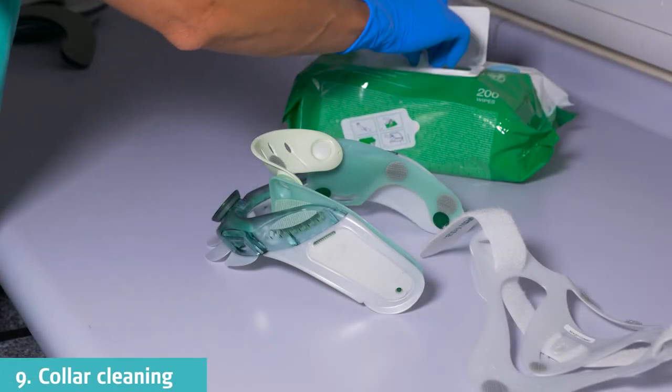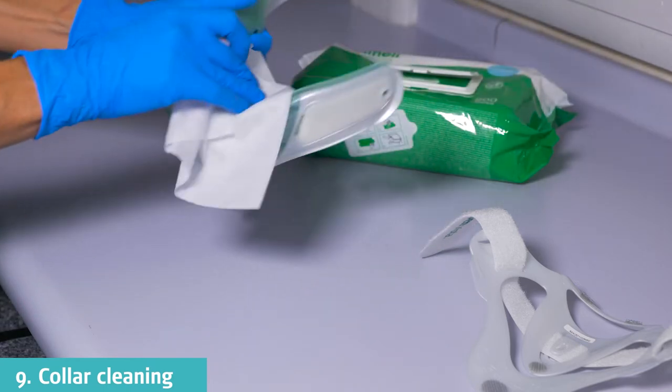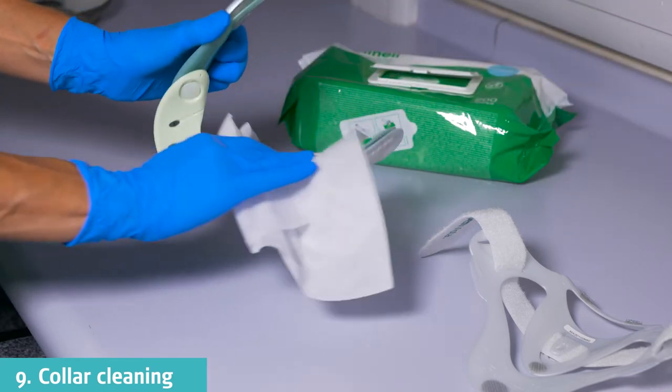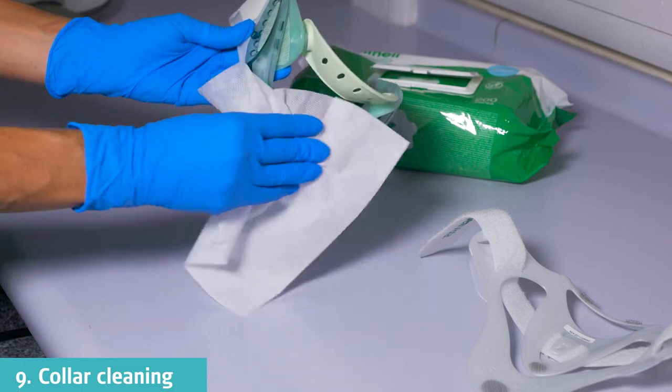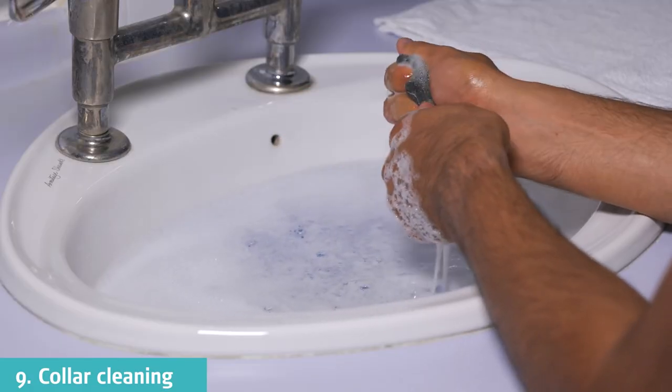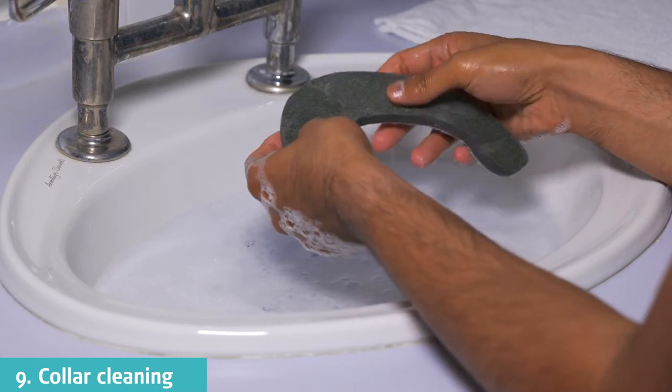The plastic components can be cleaned with either mild soap and water or a disinfectant wipe. Ensure it is dry before the pads are reattached. The pads can be hand washed with mild soapy water, then lie flat to air dry.